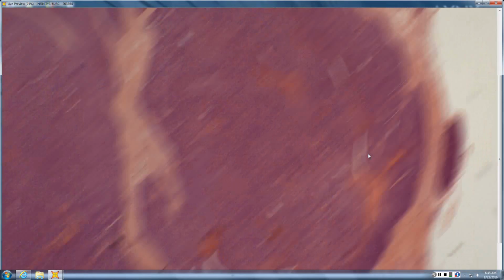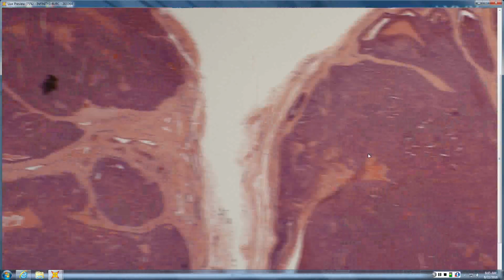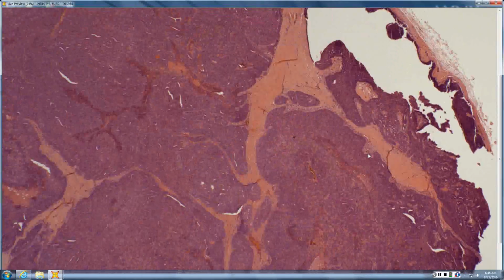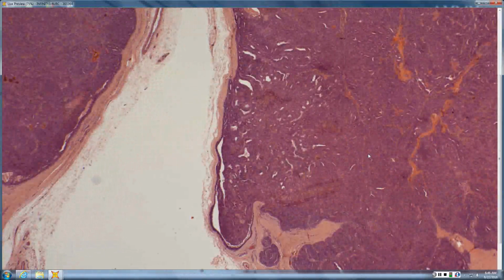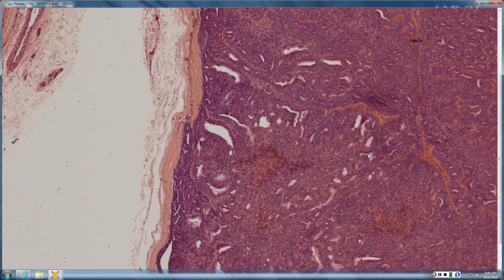Now, this is a deeper tumor. You can see there's not really even any skin anywhere, and the slide itself said digital mass. So you would need that history, otherwise this could have come from anywhere, and how do you really narrow that down? There are some features in here that would start to point you towards it being eccrine in origin, and that being, when you get a little bit closer, here's where you start to see that almost HPAP appearance. And again, we'll get to HPAP, but that's that maze-like architecture of an eccrine neoplasm.